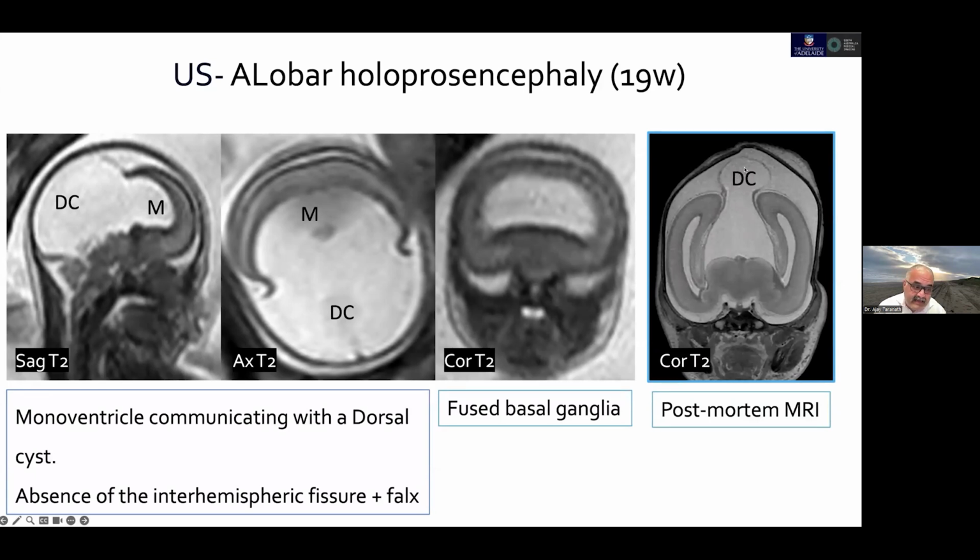It is said that the midline abnormalities associated with cysts, for example, it could be an alobar holoprosencephaly with a dorsal cyst. It could be an agenesis of the corpus callosum with an interhemispheric cyst, or it could be a huge porencephalic cyst. Now, how do we differentiate between these? The fact that you're having a tentorial dysplasia veers the diagnosis in favor of a holoprosencephaly. Tentorial dysplasia is diagnosed by the absence of a vein of Galen and straight sinus, which you can see here.